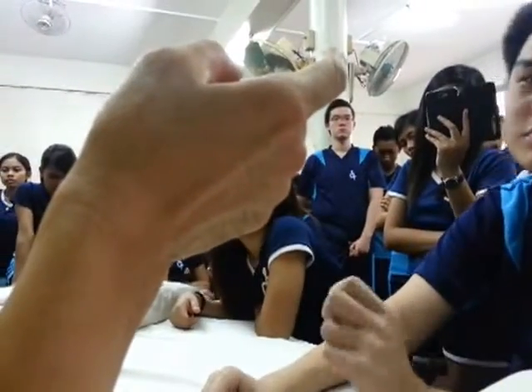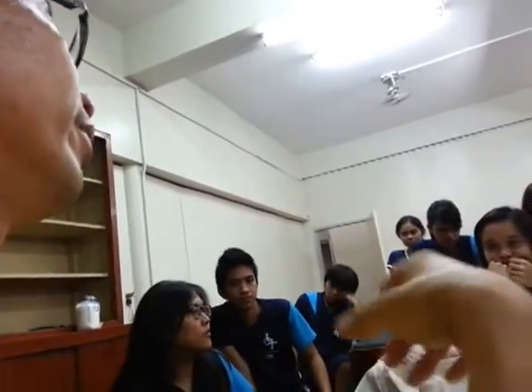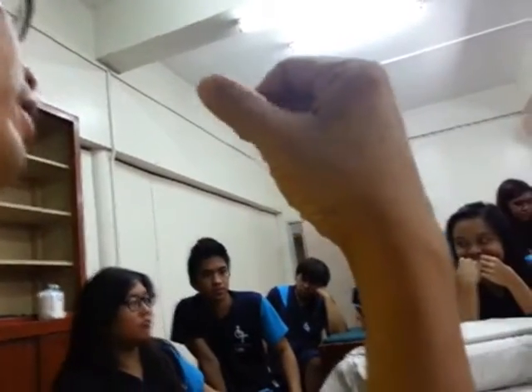After that, you're going to check for contraindications like open wounds, if ever the patient is applying any liniments, or if the patient has implants. Those are contraindicated, especially superficial ones. If the patient has applied liniments, you have to remove them. Also, accessories like jewelry and earrings, you have to remove so that you can concentrate the current.